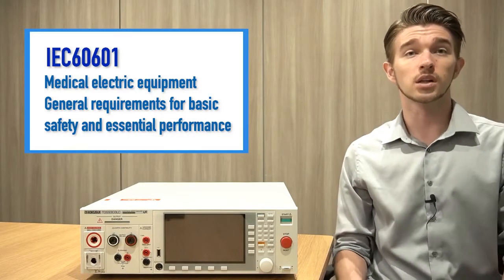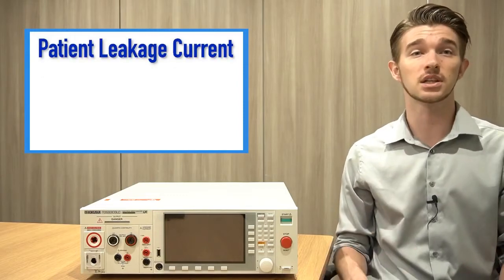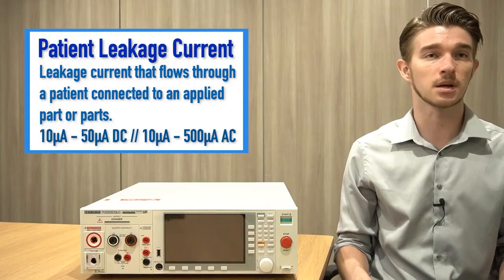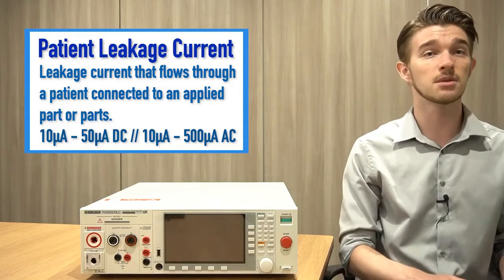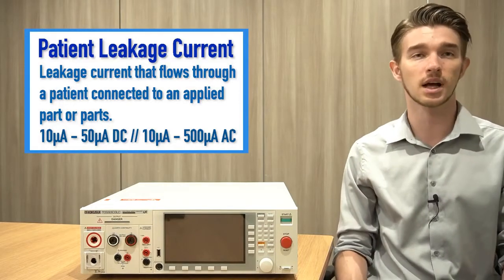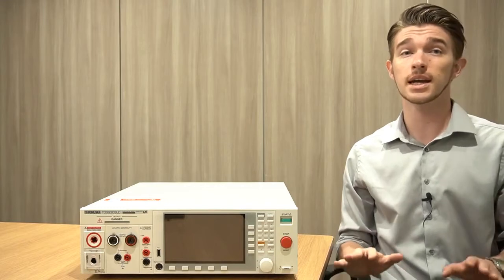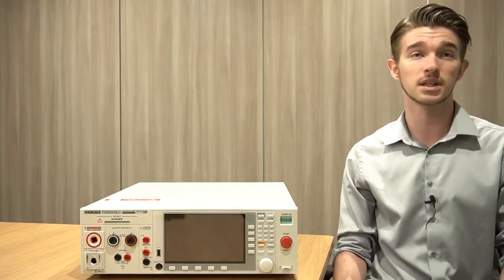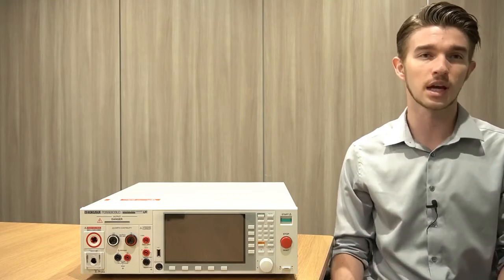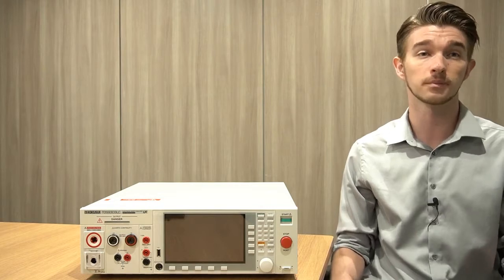These standards include electromedical device-specific safety parameters such as patient leakage current, which can range from 10 microamps to 50 microamps DC, or 10 microamps to 500 microamps AC, depending on the equipment classification. The nature of patient leakage current tests requires cutting-edge measurement instruments capable of detecting extremely small traces of leakage current, as well as terminals that output 110% of the rated voltage of electromedical equipment.